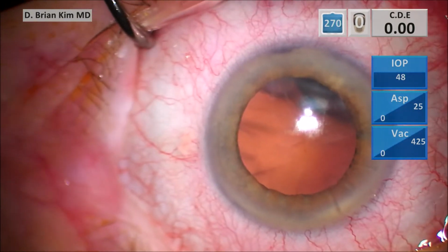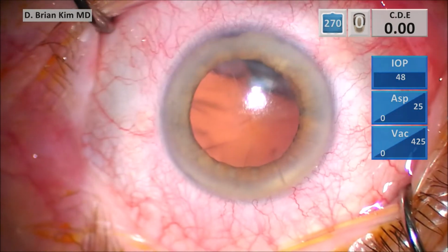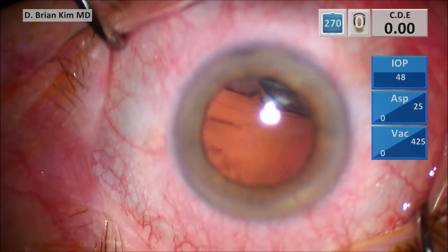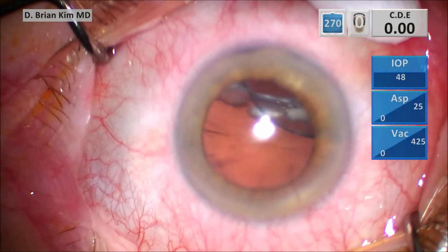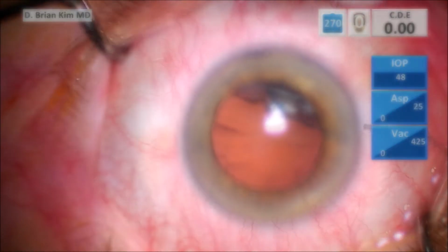And so you can see here, I'm sitting supratemporal. The lens has dislocated infranasal, and it's sitting vertical. Okay, it's hanging by a few threads of zonules. You're going to see a cool technique that I'm going to employ by strategically placing a trocar to be able to help me lift that lens up with the levitation technique using the vitrector.